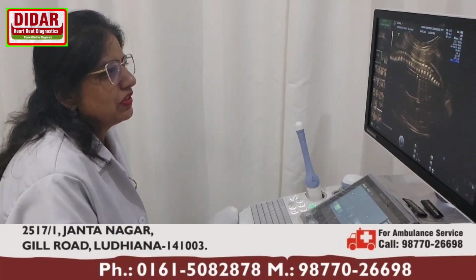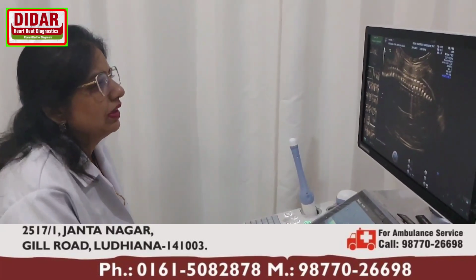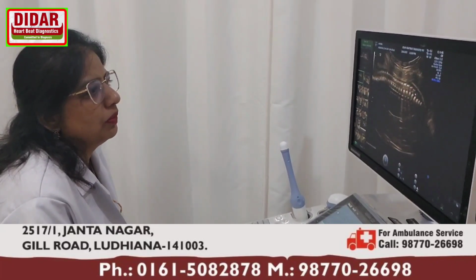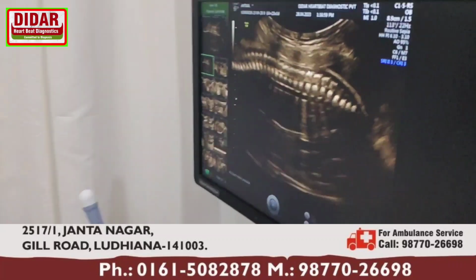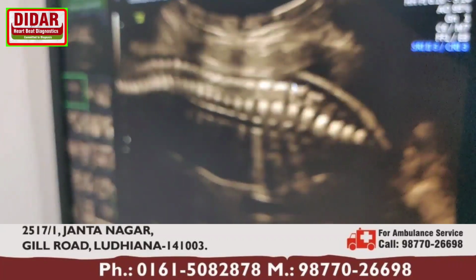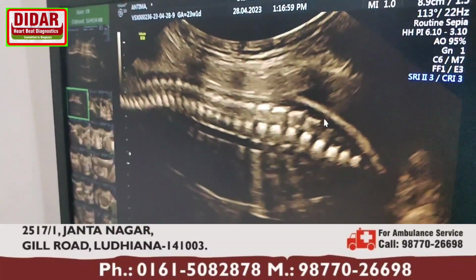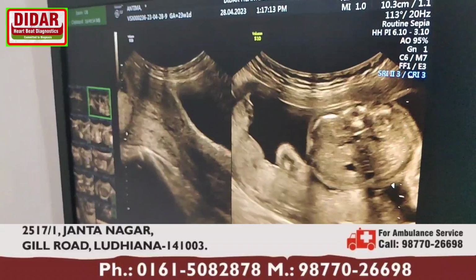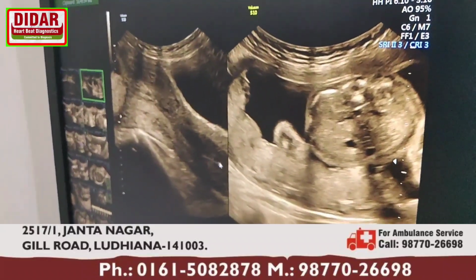Now here is one patient whom I have scanned today. First, when I put the probe, I saw the backbone of the baby. In the backbone, this is the bone, and over it there is skin. So it means there is no defect in the backbone. Next, I see the cervix, like the birth canal.